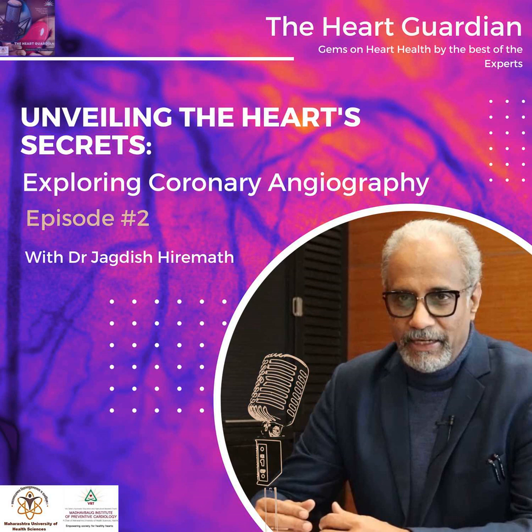That means one needs to look inside the coronary arteries. The final test, the acid test, or the gold standard for this diagnosis is to have a photograph of these coronary arteries from inside. This highly sophisticated photograph is known as coronary angiography. Coronary is self-explanatory, angio is artery, and graphy is a photograph. So graphy or gram would remain the same, whether you call it coronary angiography or coronary angiogram.